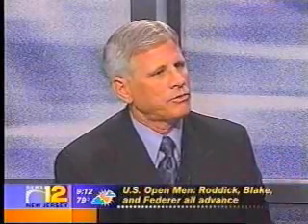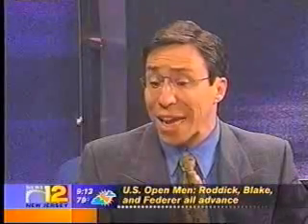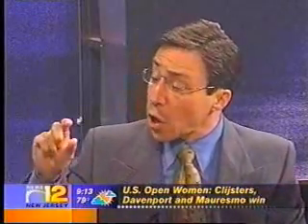Now, you said there are changes in the material. What's the change in the material that you're using now? The changes in the materials are drastic in dentistry over the last 5-6 years. The materials that we're using are company fabricated. This is not a piece of porcelain or glass that a laboratory has melted down and then has to re-solidify.